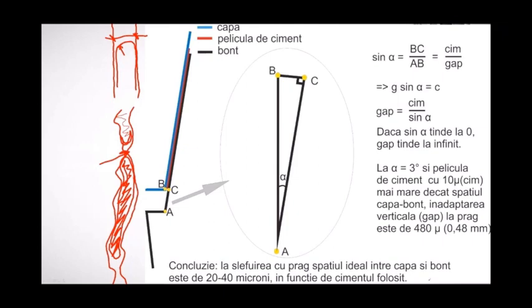Before, when we were using spacers, we would apply several layers of spacer, and you had to wait between the first layer and the second layer to dry, and it was a mess. I remember that it was like 1.5 hours just to start working, just to apply the first layer of wax on your die. Now with the milling machines and the CAD, it's easier.